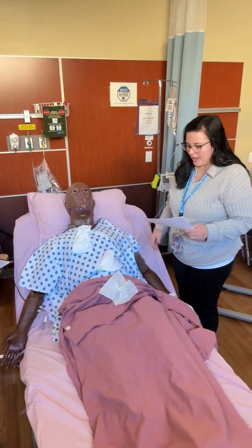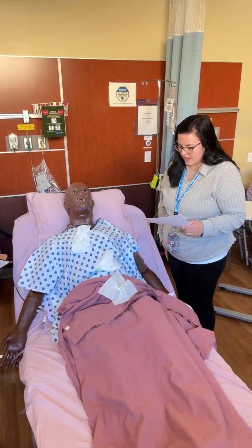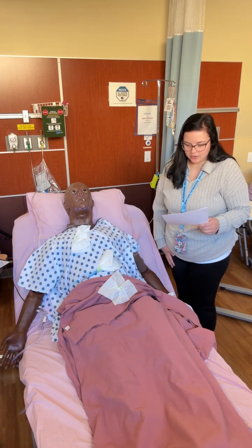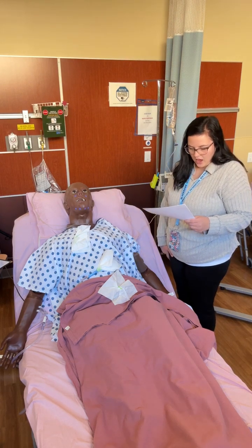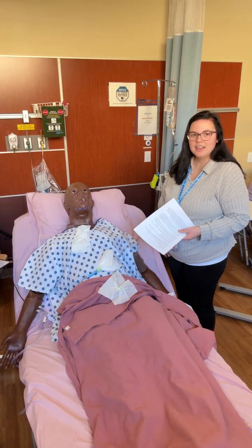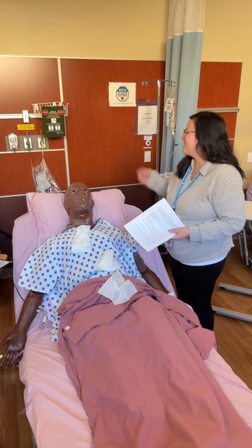So this is your simulator. The simulator's name is Hale, but your patient's name today is going to be Stan Mann. He was admitted last night and is on the med-surg floor at the hospital. The first thing to note about him is that he's in droplet precautions.